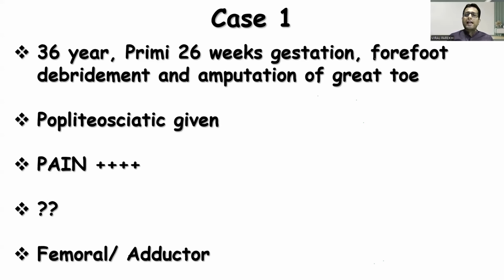After adding 5 to 10 ml of local anesthetic at that level, the patient's pain disappeared and we were able to continue the case only under block. In this patient, general anesthesia was definitely to be avoided, and we finished the case. So the importance of this is that we need to know the dermatomal, myotomal and osteotomal coverage.